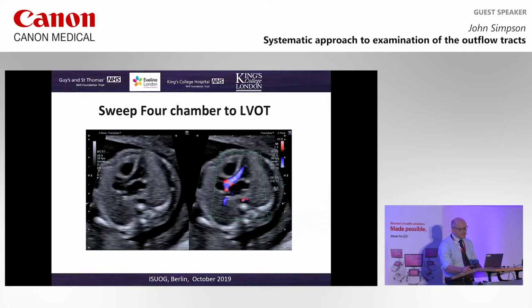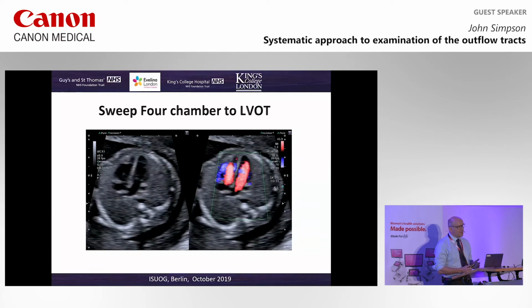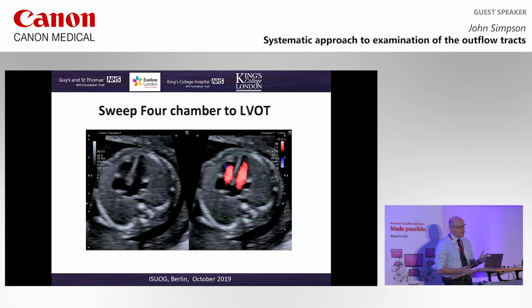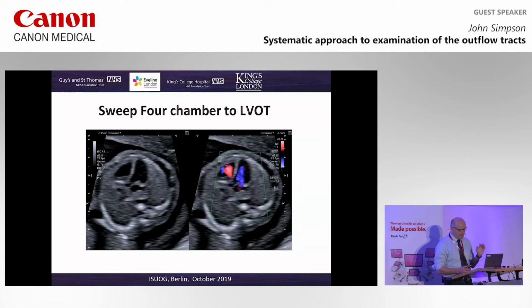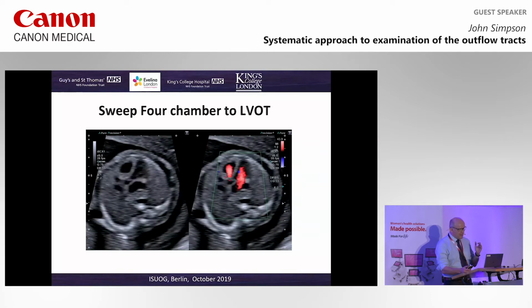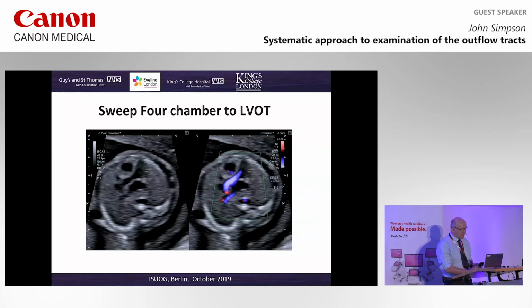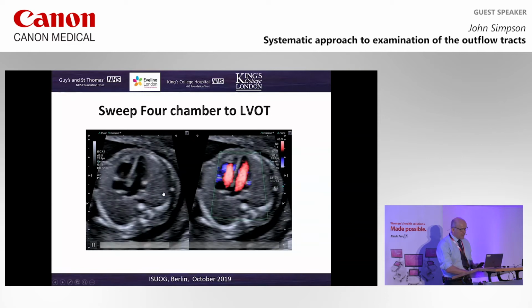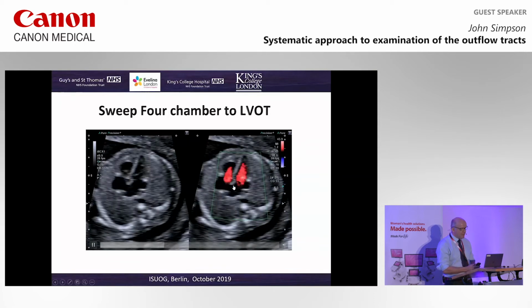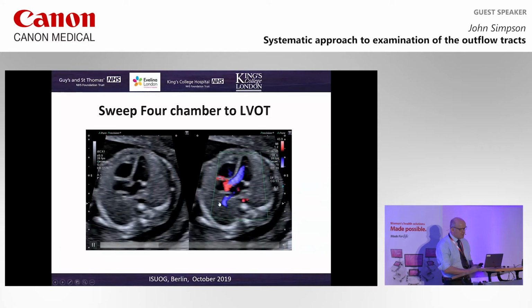And in practice, this is essentially what we're doing. You can see we've just moved very slightly from a four-chamber view, angling up towards the baby's head. This is a very fine movement. It's a fine pencil movement, not an orthopedic movement, and it is to bring in the outflow tract. And you can see very nicely the continuity, again, as I've mentioned, between the mitral valve and posterior wall, and the septum and the anterior wall of the left ventricular outflow tract, and the direction towards the fetus's right shoulder.